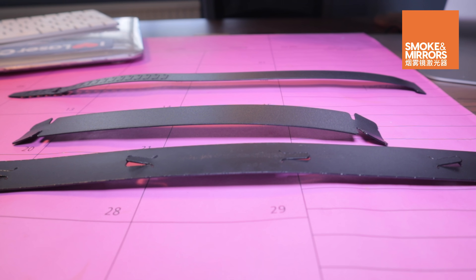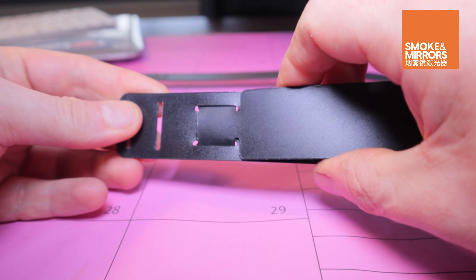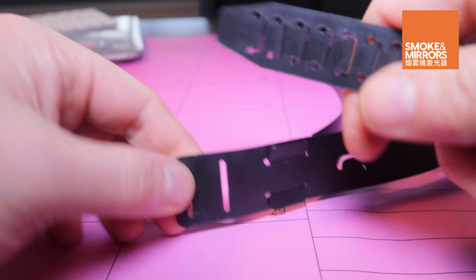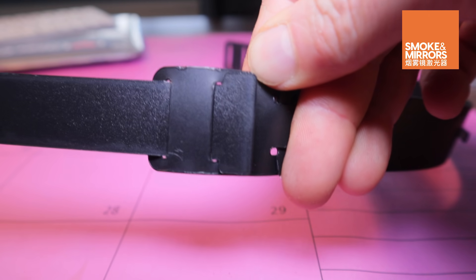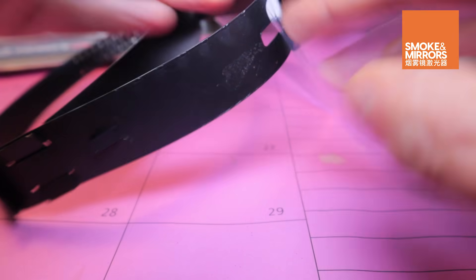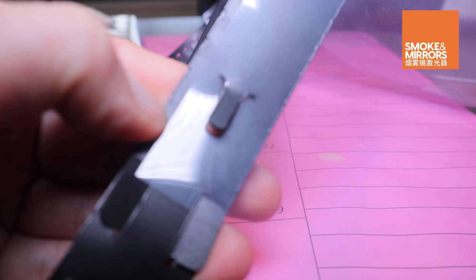First, add the forehead spacer to the longest section. Next, add the adjustable strap. The PVC sheet can be fitted once you've added holes with a hole punch. Use the lugs on the longer section to tightly secure the sheet into position.